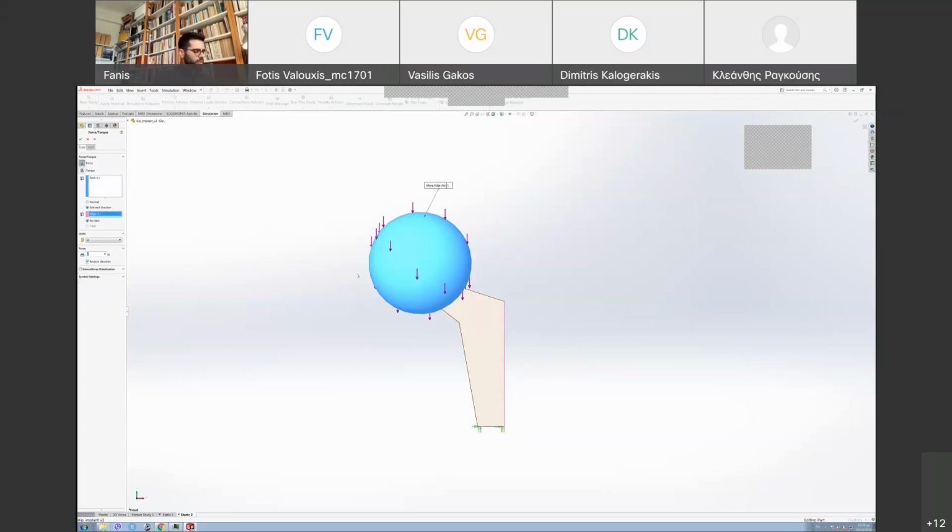Here you can put the force in Newton. This can be, for example, 700 Newton approximately for someone who is 70 kilograms. And that's pretty much it. Now we have the force, we have the constraints. Because SolidWorks is a more user-friendly software, you don't control a lot of the parameters. It does this for you.